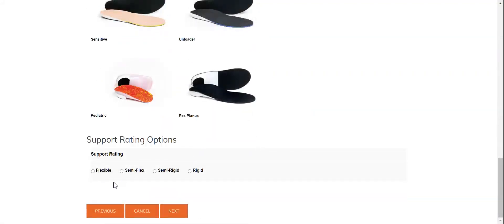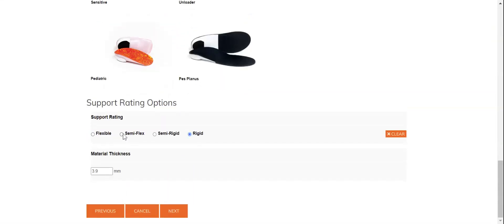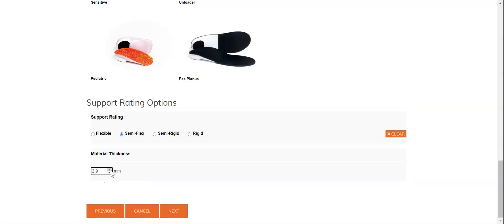Right down here at the bottom you'll see a support rating option from flexible all the way up to rigid. As I select, say, semi-flex, the computer automatically calculates that the thickness for somebody of 150 pounds weight is going to be 2.9 millimeters of polypropylene. If you're familiar with the flexibility of polypro and want that to be a little firmer or more flexible for that specific patient, you have the option to guide this up or down by 0.1 millimeters in either direction, so you can fine-tune this to your heart's content.